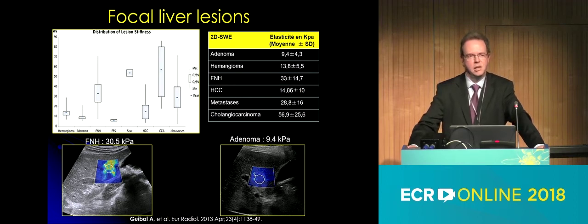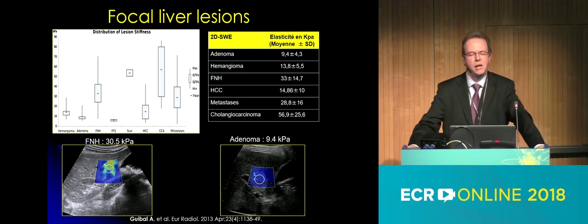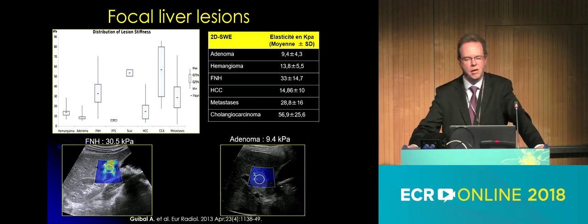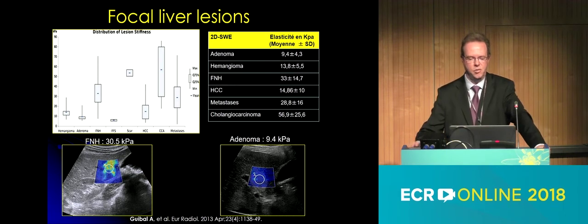FNH is much stiffer than the other benign lesions, particularly compared to hepatocellular adenoma. So this technique could be a helpful tool to distinguish between FNH and adenoma.